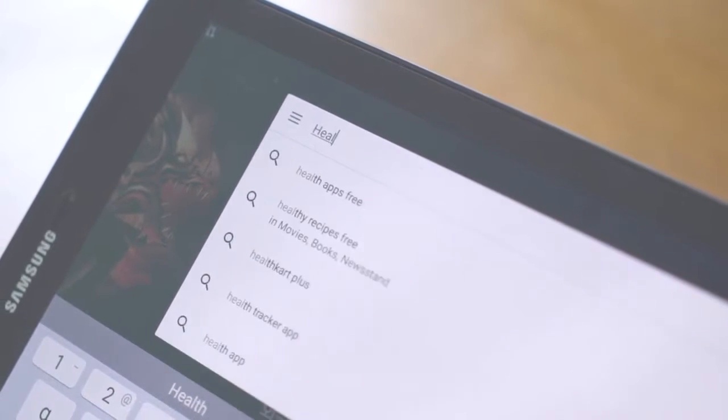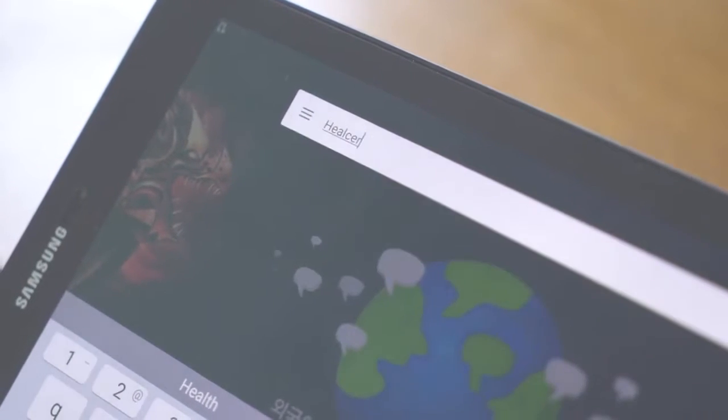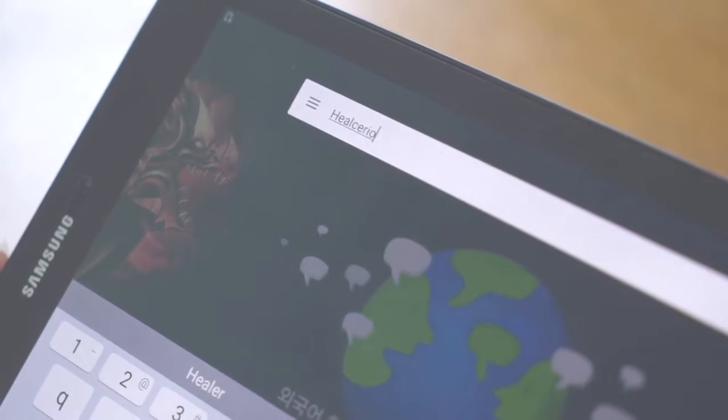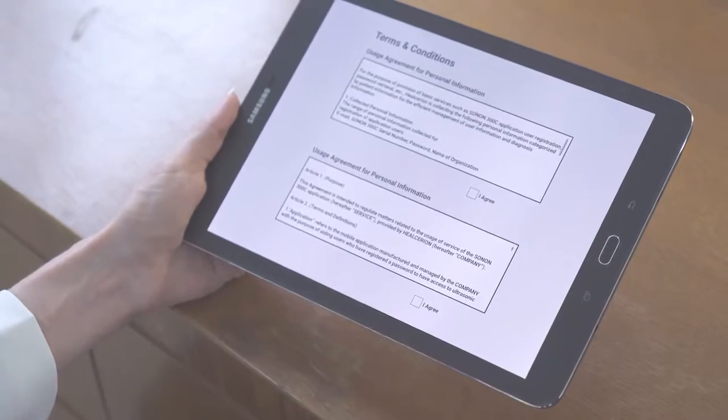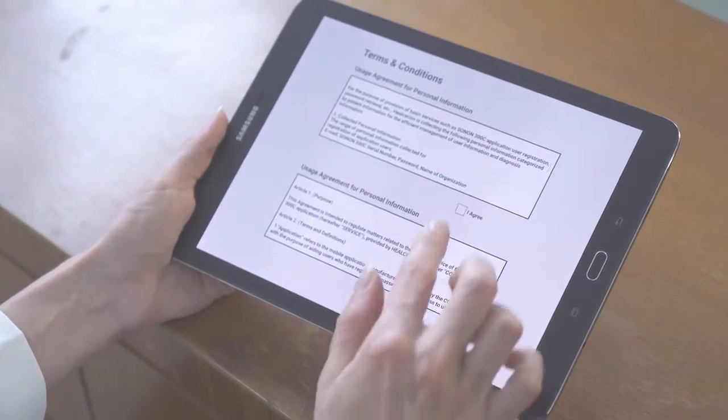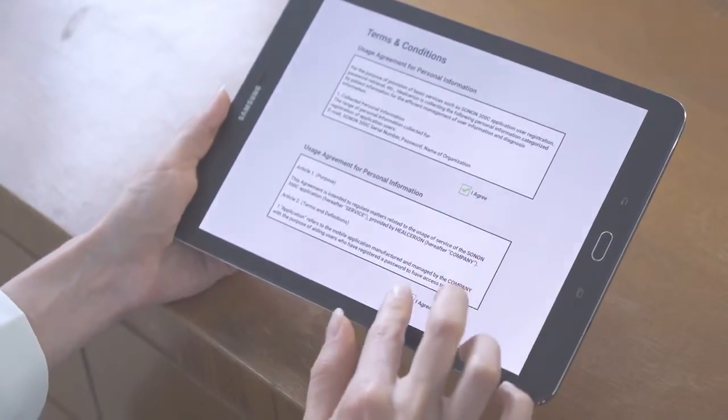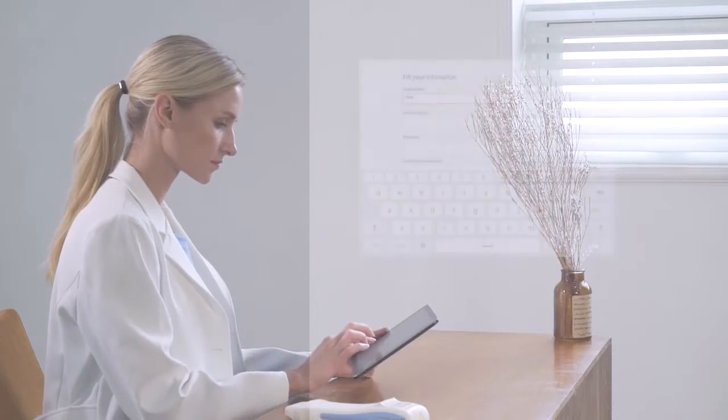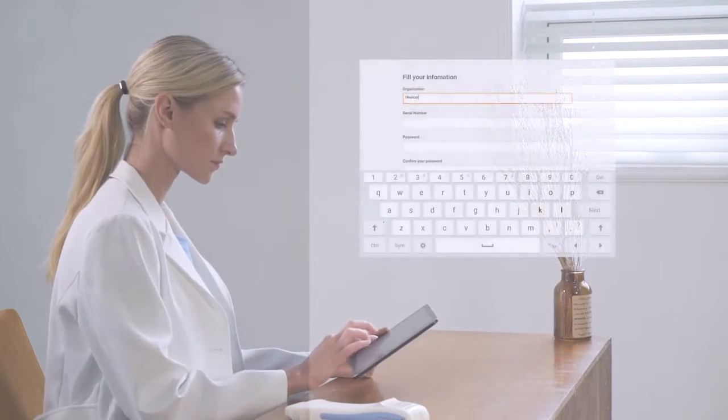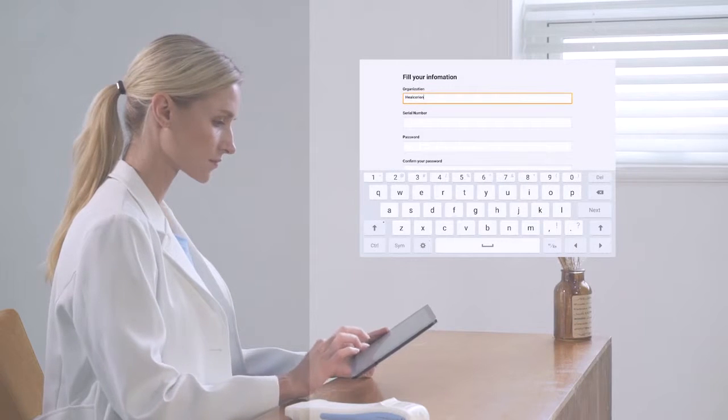First, search for Healcerion and download the app. Then, agree to the terms and conditions, then fill in the required information for registration of the device.